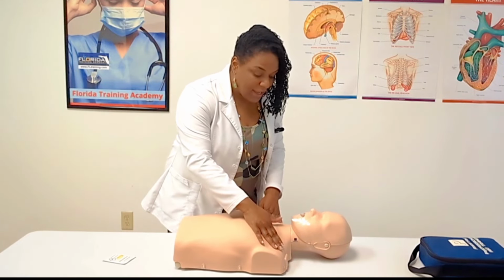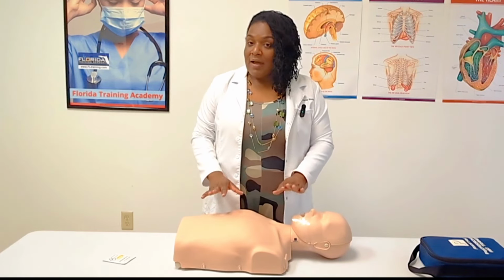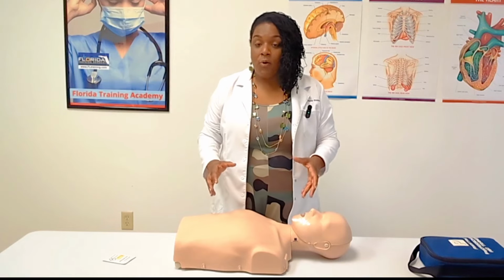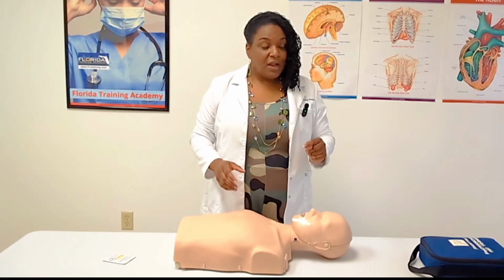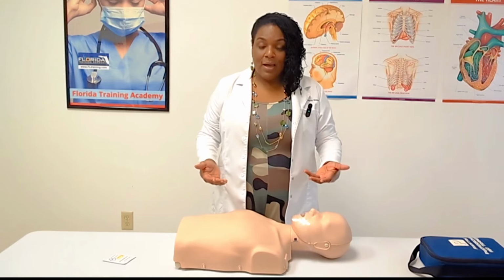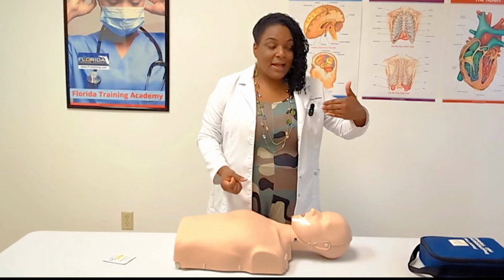Hey, are you okay? Once I realize that this person is not responding, I don't have to check for a pulse or breathing right now. What I need to do is get help. I need to alert others. If you're in the hospital, you're going to press that code button. If you're in home care or outside in public, you can scream for help, tell that person, hey, you call 911 and come back.